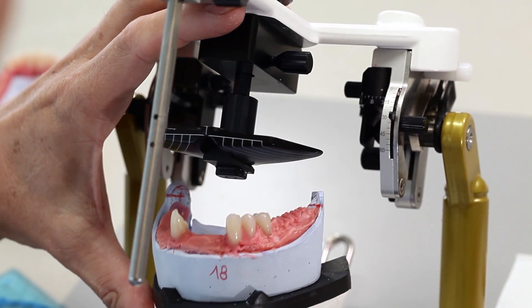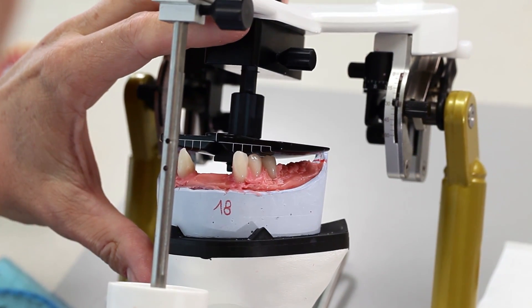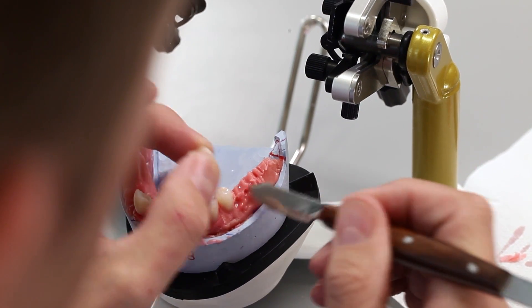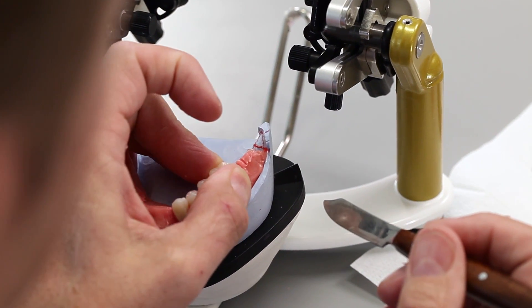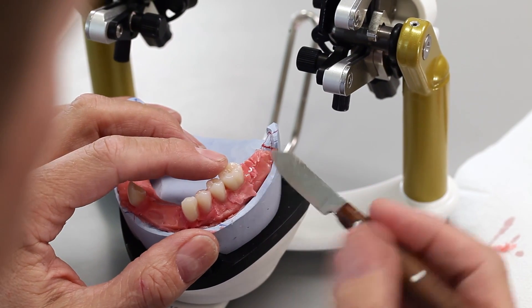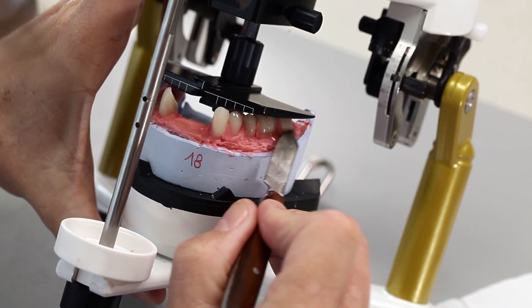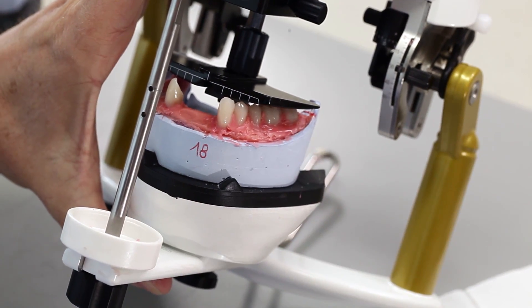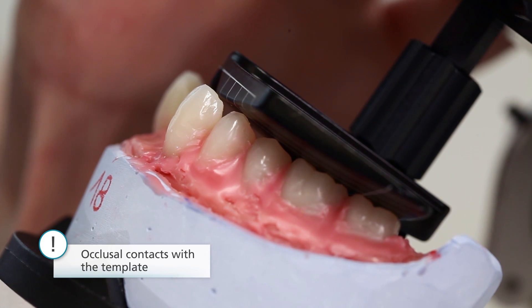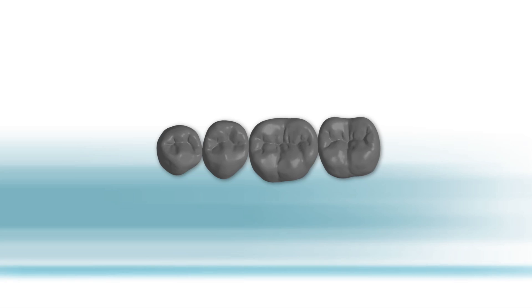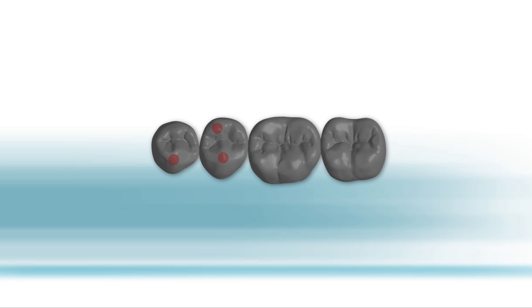Pound's line and the center of the alveolar ridge are reference points for the orientation of the functional corridor for the posterior tooth setup. In this way, the lingual and buccal limit and the statics are taken into consideration. The posterior teeth have contacts with the template as follows: The first premolar with buccal cusps. The second premolar with buccal and mesiolingual cusps. The first and second molar with mesio and disto buccal as well as mesiolingual cusps.